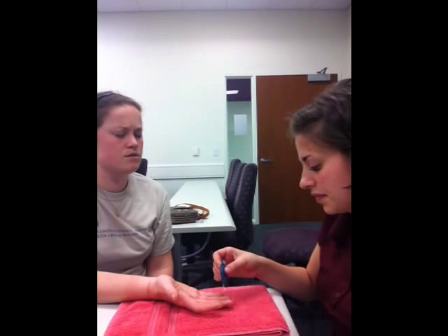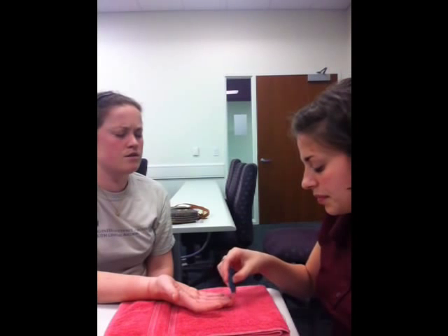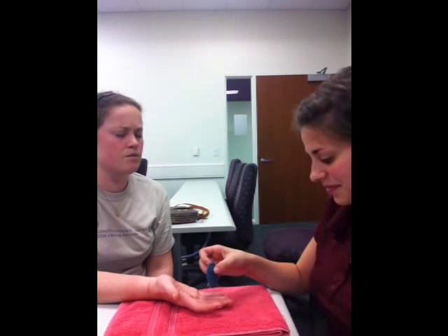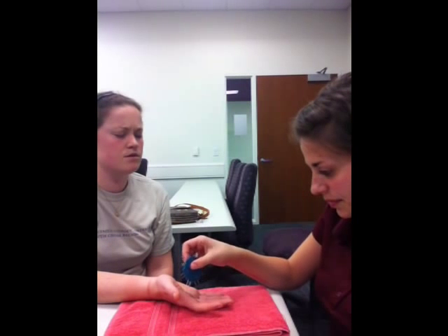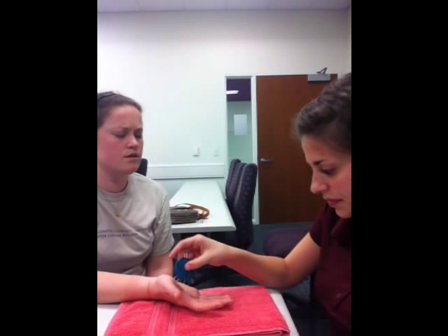One, one, two, two, one, one, two, one, two, one, one. Okay, next one.